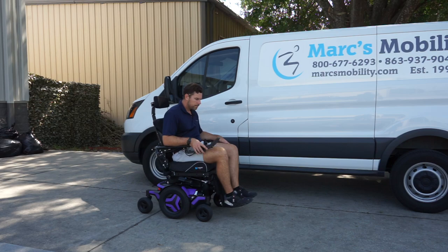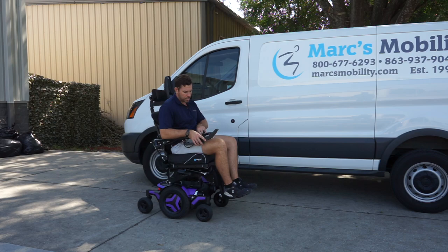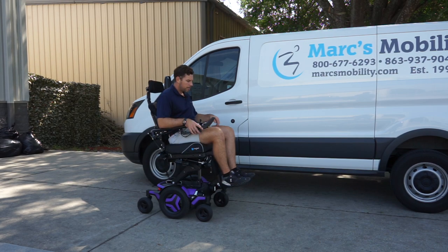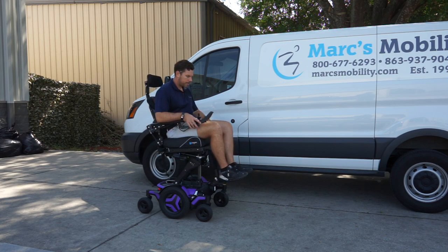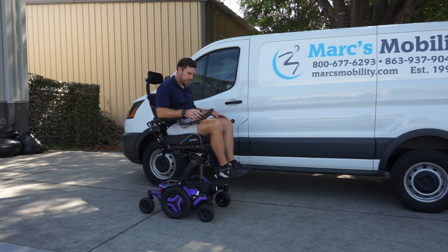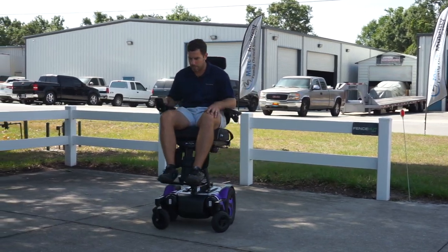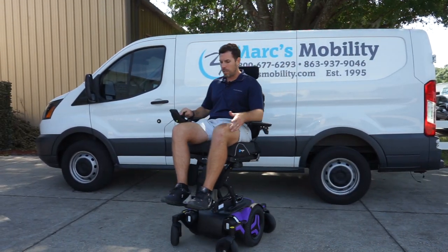Now that I'm in the fully elevated position — about 34 inches top of seat to the ground — we'll see what the top end speed is. Top end speed elevated is looking like 3.3 to 3.5 miles per hour, and you can see it's plenty stable. Even at 200 to 220 pounds and six feet tall driving it around, it's a fantastic unit.